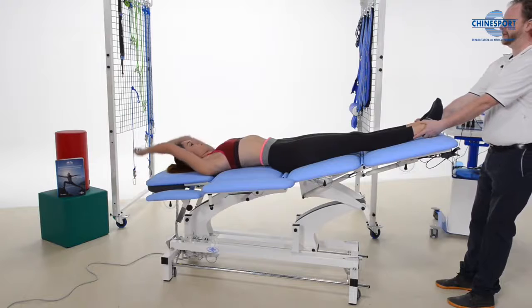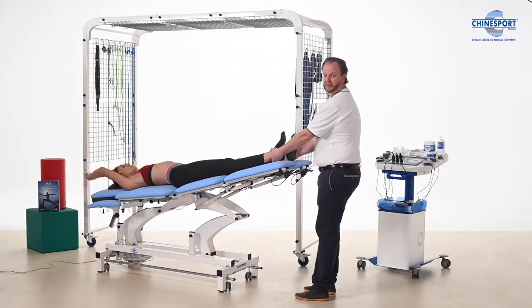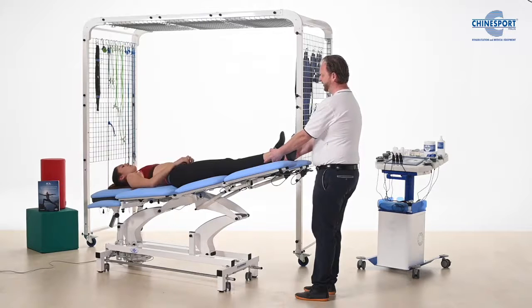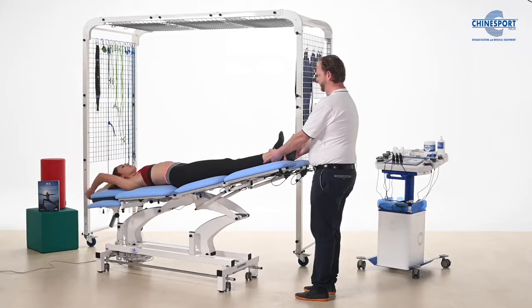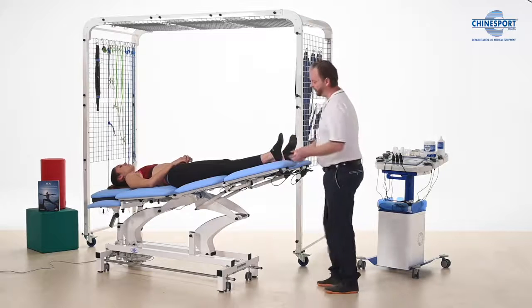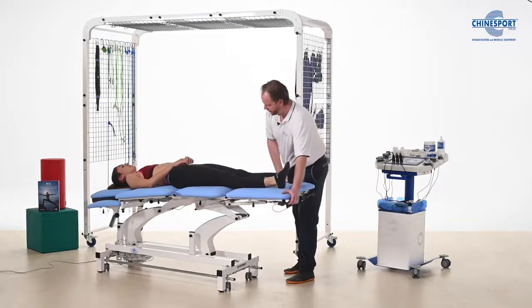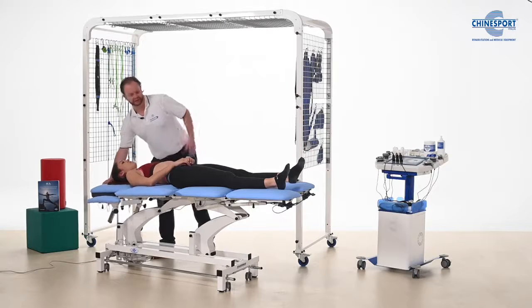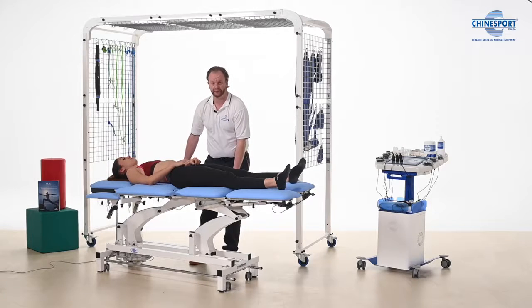And she can move her hands back and up again and simply become aware of what's happening in the spine and become aware of the sensations, the kinesthetics, maybe even the emotions, some fear avoidance behavior, maybe we can talk about that. So this is all very quick in a few moments. She can lie in this position for ages, really, if you want to provide some traction.